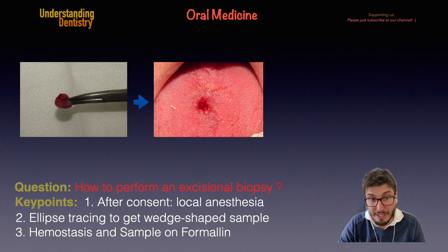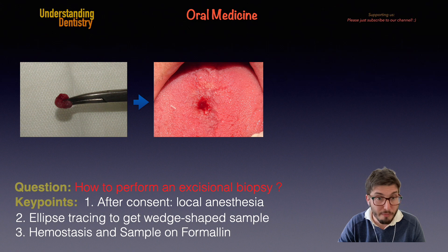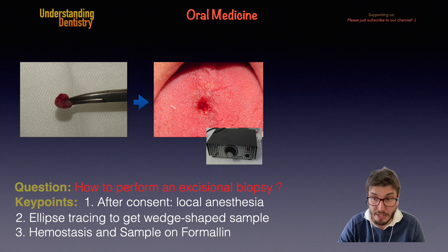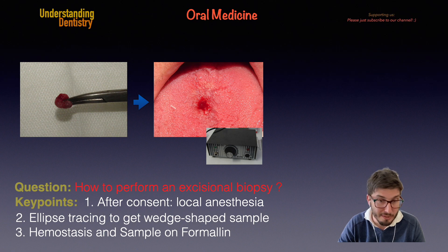Of course there are blood vessels at the site, so now we need to control the bleeding. We can do this with sutures, or — if it's a small lesion like this — we can use an electrical scalpel to cauterize the area, which is exactly what we did here.